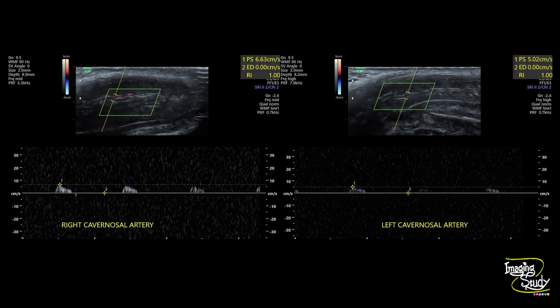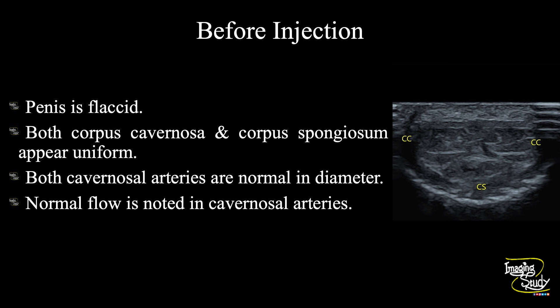Here is the Doppler sample we collected from the cavernosal arteries. It's usually very difficult in the flaccid state to get these waveforms, so reduce the PRF or use power Doppler to visualize them. The peak systolic velocities were around 5 to 6 cm/s with no forward diastolic flow, so the resistive index was 1. Before injection the penis is flaccid and both corpus cavernosa and corpus spongiosum appear homogeneous with normal cavernosal arteries.